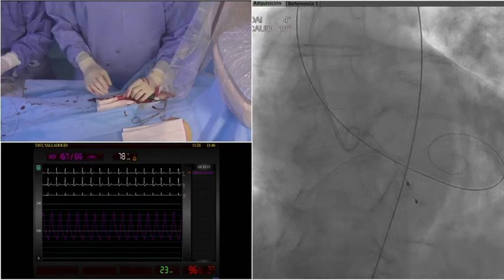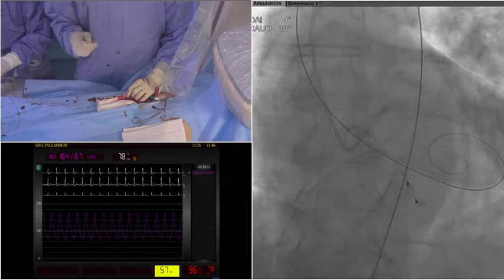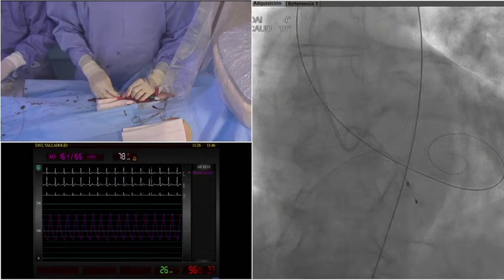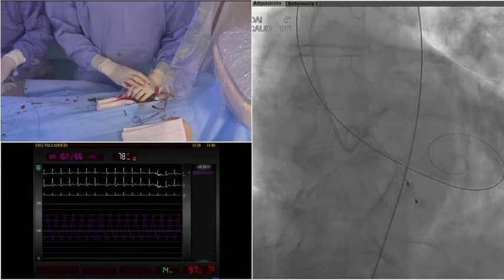Yes, it's important. Of course, this is an expandable introducer, so you have to check the tip of the introducer when you are going inside with the valve mounted on the balloon to make sure that we don't get attached. If so, you can rotate a little bit the delivery system, and normally it works. Okay, fine. That's interesting. I have only done that once, so this is my global experience with that.